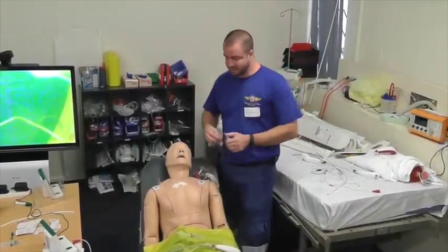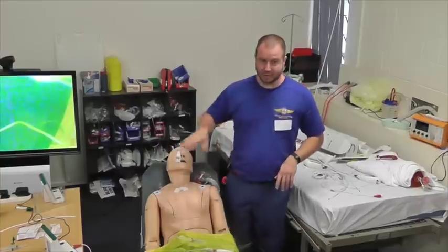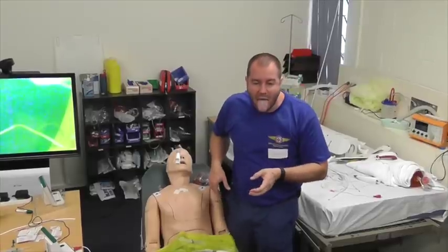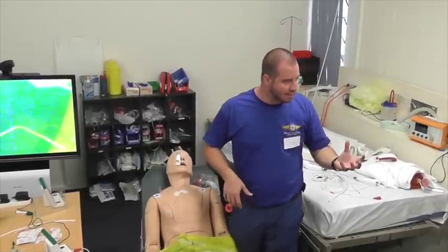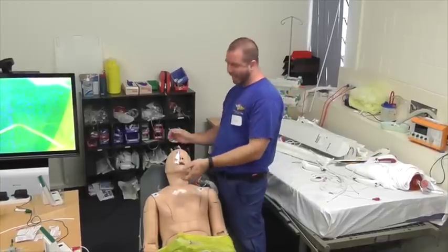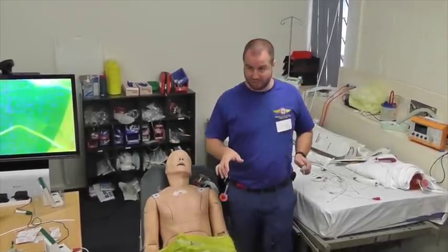Once I've got that nasopharyngeal in, I will spray through that nasopharyngeal. I won't leave it like that, but if I can get the patient's compliance to be able to say, can you stick your tongue out for me? What that does is it brings all that anterior structure forward, and if you can get them to do that and spray, they usually cough at that point.